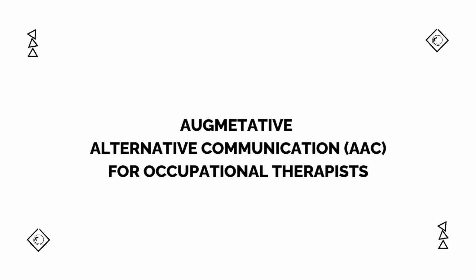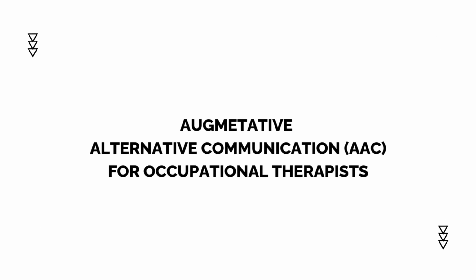Hello and welcome to this tutorial video for Augmentative Alternative Communication, AAC, for occupational therapists. AAC is a tool utilized for functional communication for the pediatric and adult populations across the nation. It can appear very daunting for many clinicians, so this video is made to help ease those nerves a little bit.